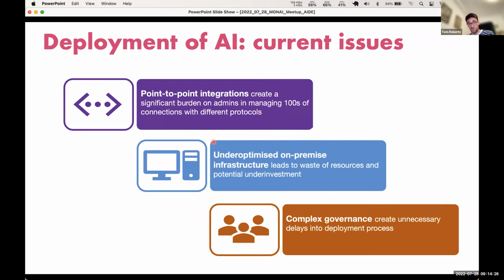You can also imagine that if you have an AI product that is installed in a hospital, it might come with some kind of potential hardware that the company wants you to use with that AI because it's optimized for that hardware. The hardware meets the standard of the AI. But then you could also have a scenario where another company wants to put in a piece of hardware, and another company wants to use the cloud, or another company wants to use a separate piece of hardware. So you will have all these resources on the hospital site, but they might only be used for that one piece of medical AI technology. So there might be periods where they're dormant, for instance. So those resources are not being used. And again, that's kind of an underinvestment scenario.